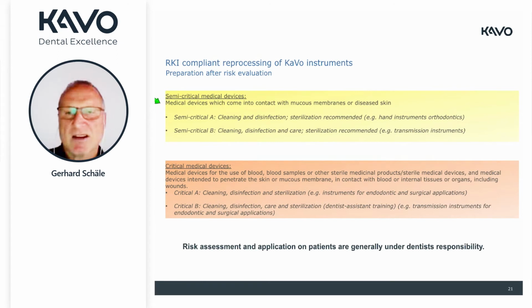Here it's written down here, in contact to blood or internal tissues, or organs, has to be, and that's by German law, Robert Koch Institute, first placed into a thermal disinfector, and second, and this is not only a recommendation, this has to be done, into a autoclave.